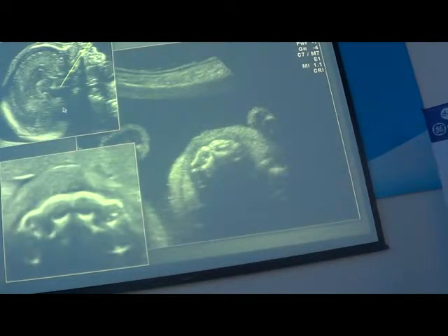With this section, you can see the upper maxillary, that means the alveolar ridge. This is made with a standard probe. Ở đây thì với đường cắt lên qua xương hàm trên, các bạn sẽ thấy. And this is made with a high frequency probe, and you can see the buds of all the teeth. Và cả thấy các nụ răng.